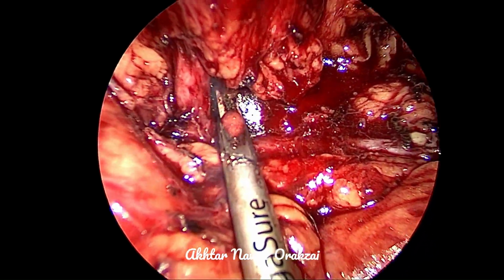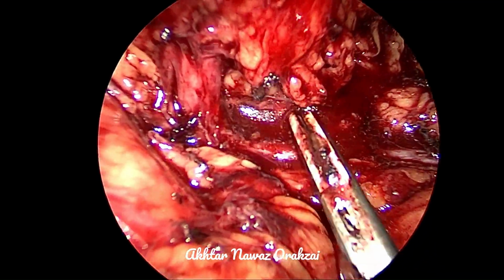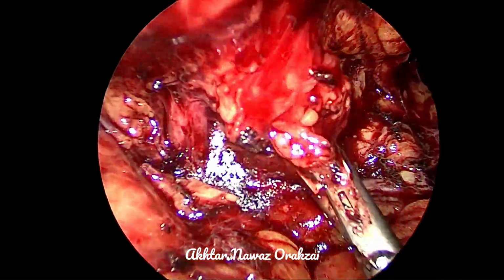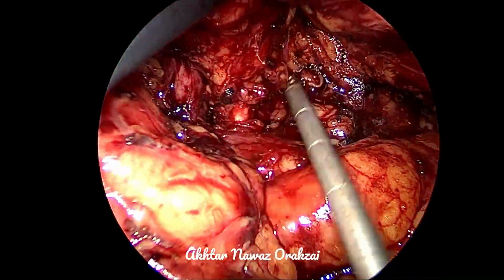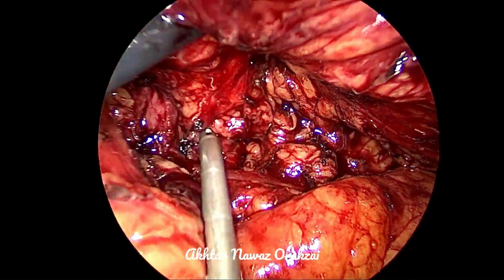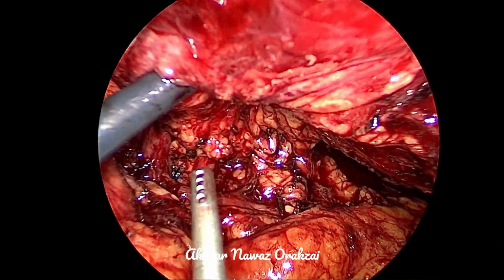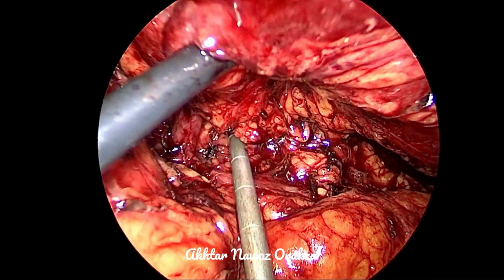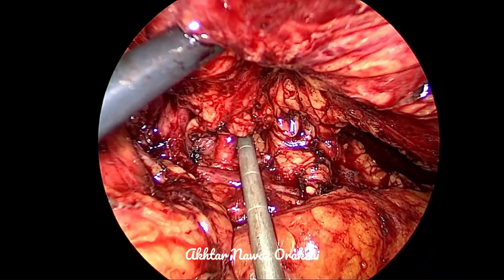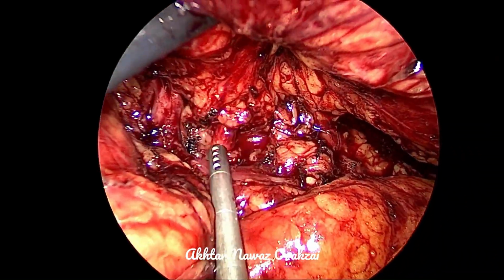and according to the study of the CT, the artery was located inferior to the vein in a very typical position. So we were lucky here that the artery was not behind and superior to the vein. Although there has been a lot of inflammation, the hilum has been kind enough to be in a typical position. So you can see here the artery.